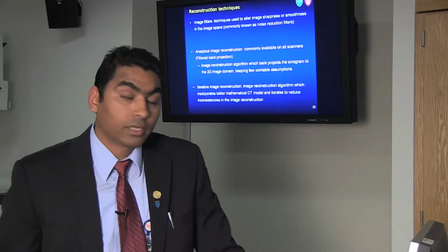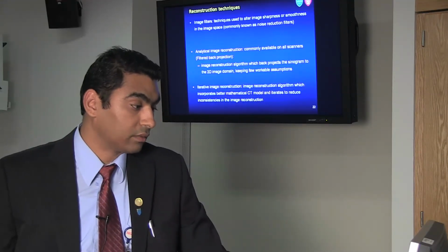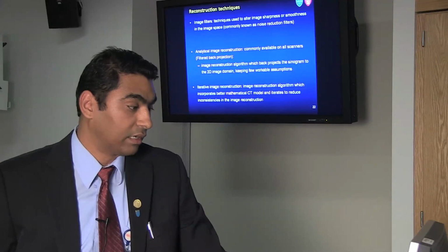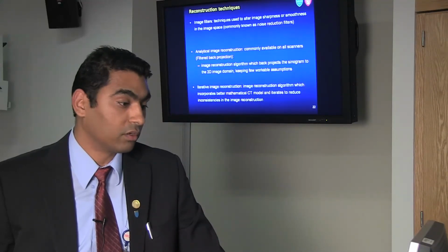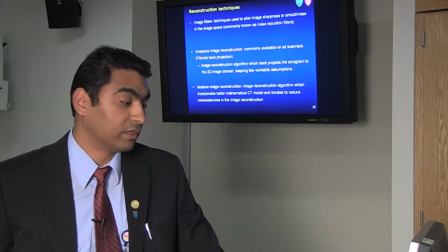The next parameter to look at is the reconstruction techniques. As we know, there are several new techniques coming in the market now, so it's important to understand what the definitions of these techniques are. So let's look at image filters. Image filters is a technique used to alter the image sharpness or smoothness in the image space, and this is commonly known as noise reduction filters.